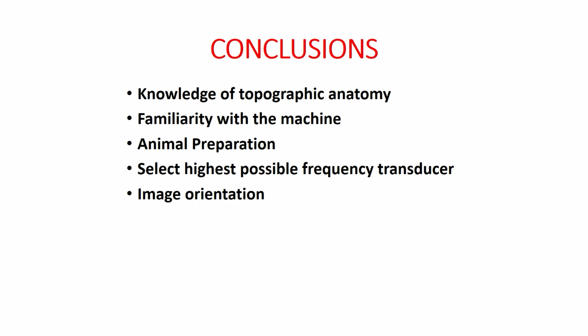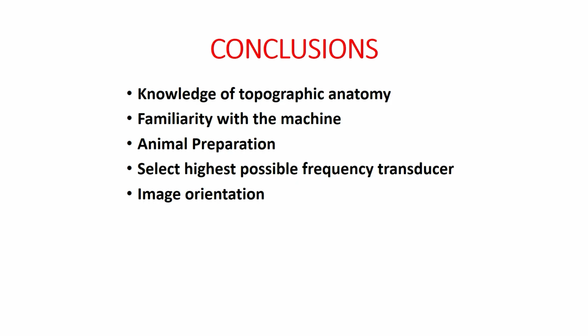Now we conclude today's lecture. The ultrasonologist should have proper knowledge of topographic anatomy so that he is able to perform the ultrasonic examination. He should be very familiar with the machine so that artifacts can be minimized.